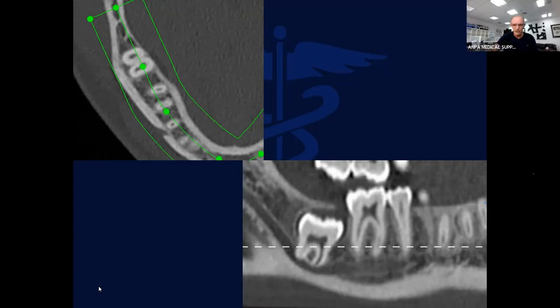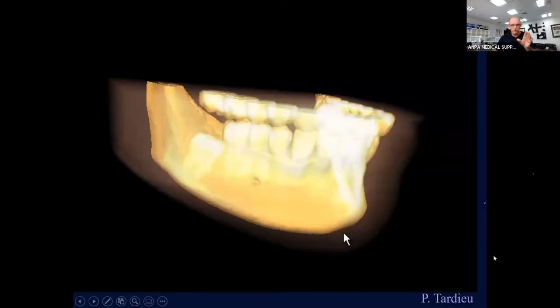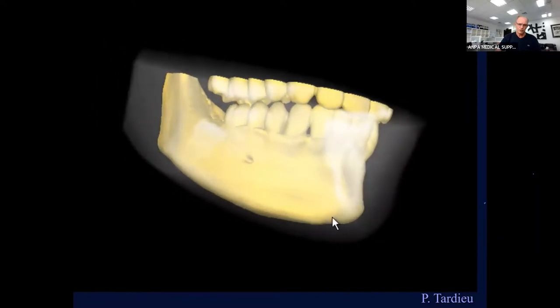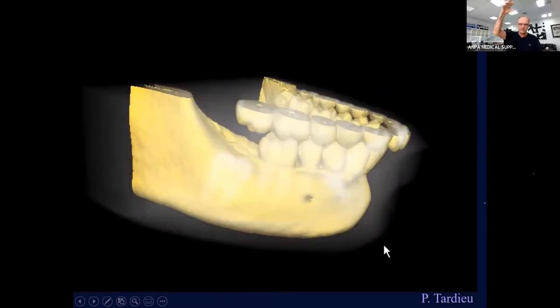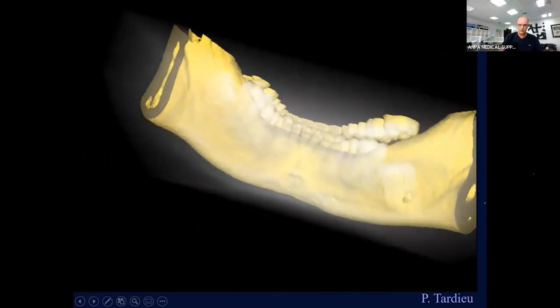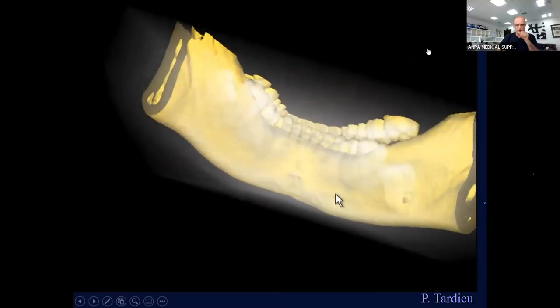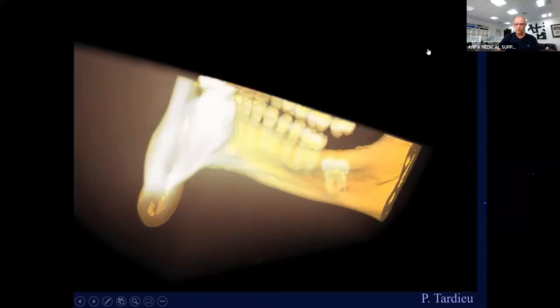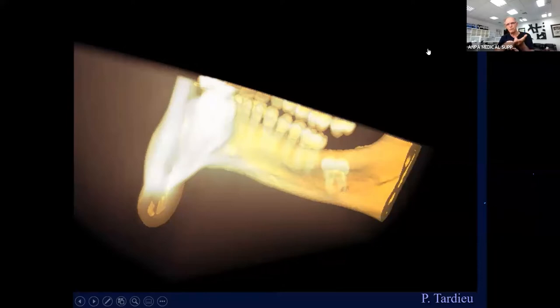The next step is volume rendering. You have this kind of image in all existing CBCT software — 100% of them give you a dynamic image rebuilt in volume rendering, meaning pixels reconstructed in the air. I can see there is an impacted tooth, but I cannot determine the relationship between the roots and the nerve. In 2D I cannot make the decision; in 3D volume rendering I still cannot make the decision. This is why we need to go to the next step: surface rendering.